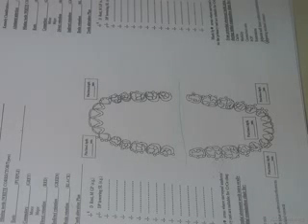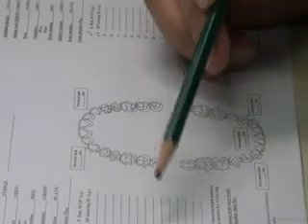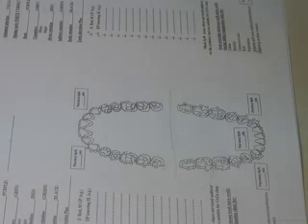lingual tori, for example. You have an undercut, a bony undercut. And you think by your design you're going to overcome it, but once you finish your design, you find that there is no way that I could overcome this undercut. The only option left is surgery. So I need to write down that this patient, I don't do my final design unless I do a surgery for this, okay?